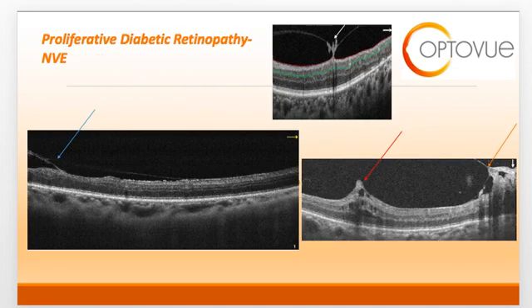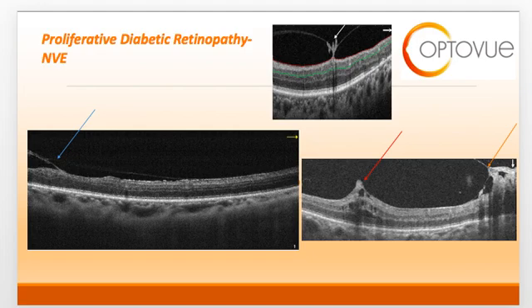Proliferative diabetic retinopathy is characterized by neovascularization, or the formation of new retinal blood vessels arising from either the optic disc, retina, or both. Neovascularization on OCT can be seen as loops of hyperreflective blood vessels protruding into the retina. Here you can see what neovascularization elsewhere looks like on an OCT. Remember to look at the vitreo-retinal interface since neovascularization will extend anteriorly off of the retina into the vitreous base.